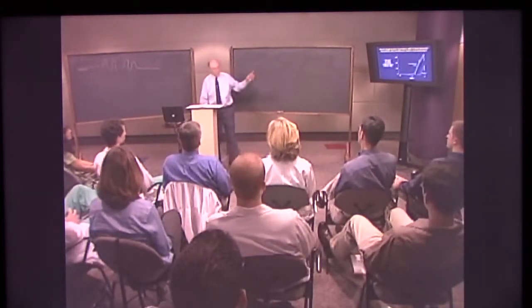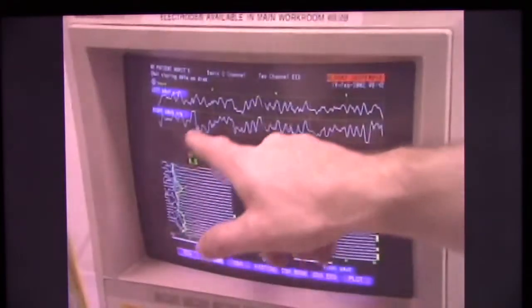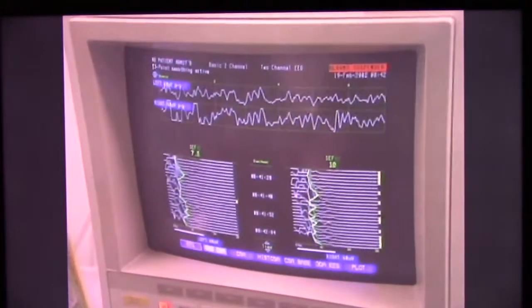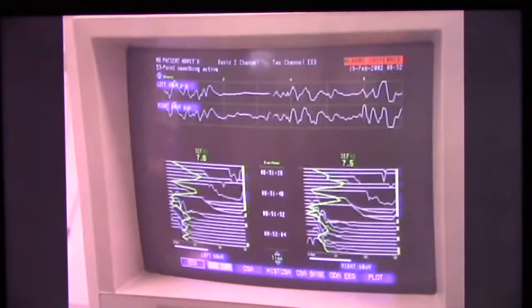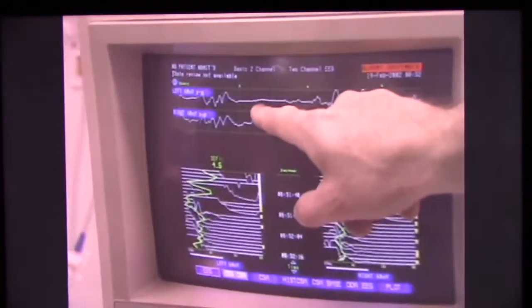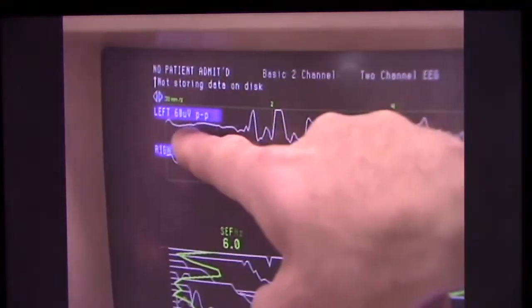Let's see a couple of EEGs in the operating room. Can you liken this pattern to anything that we've seen before? Well, we saw a similar pattern when the patient was somewhat awake but sleepy, with a BIS reading in approximately the 80s. We see the alpha waves. Look at this quickly. Well, what do you see? That was some burst suppression that we just saw there.